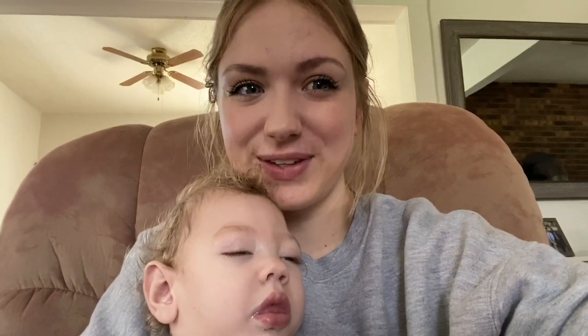Kendall is getting extremely tired — you can see it in her face. If she falls asleep I can lay her down with the G-tube pump still going, which is actually a positive of having the G-tube: I can lay her down, move her, and do things while she's getting fed. We still have about half a bag left, so I'll probably just wait, clean her tube, and then lay her down.